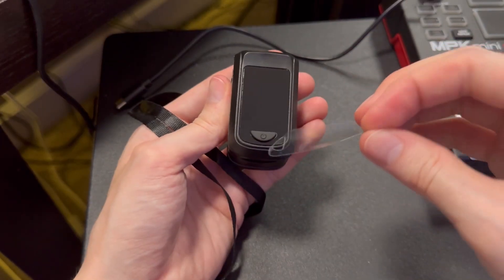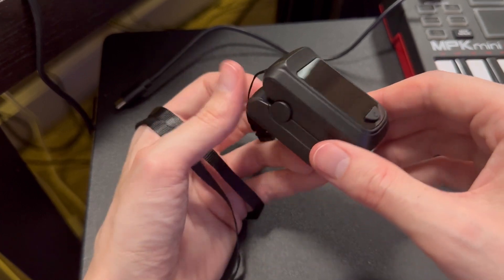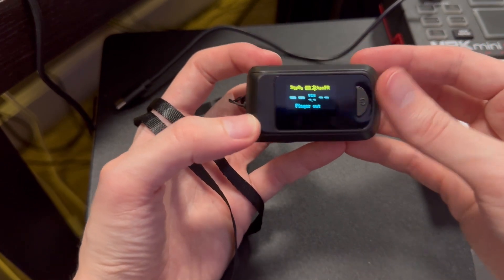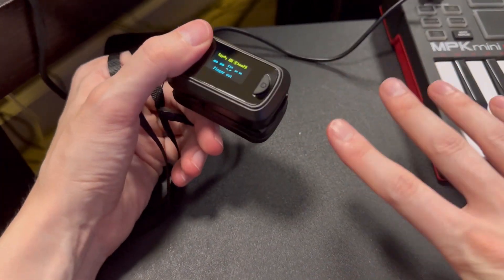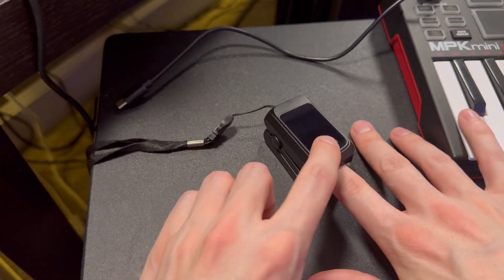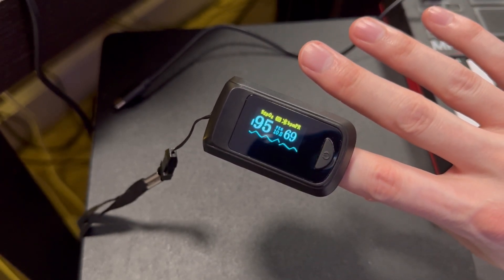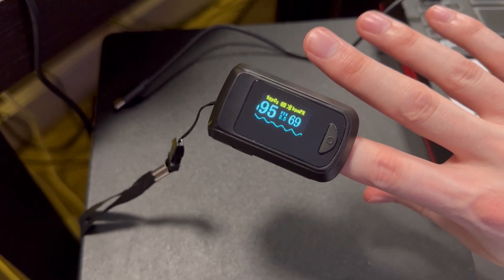Now let's take this off so we can have our screen all shiny and bright. Let's turn it on — there we go. This is going to start it up with our reading. When we use our finger, we place it inside just like this. Let's start it up again and see what we get. Here is a reading: we have 95 for our SPO and 69 for our pulse.